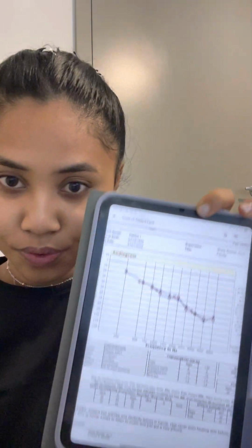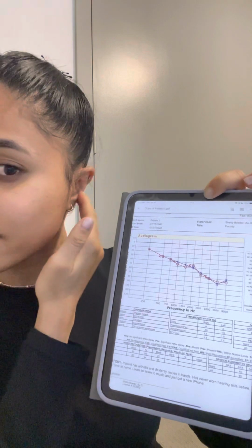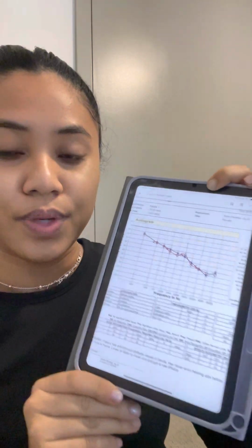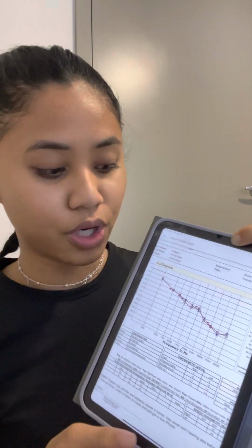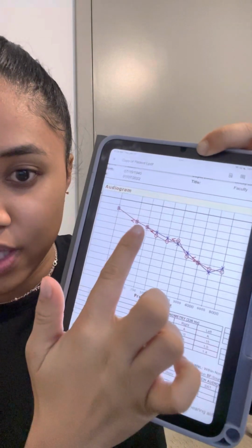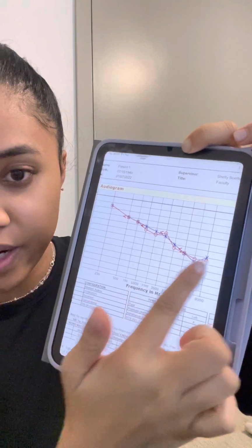All right, we are going to go over the results of your hearing exam. So I'm going to show you the graph as we go along, and I'll explain it as we go down. This is the results of your hearing exam that we did, where you listened for the tones that I gave you, and you pressed the button each time you heard a tone, even if and especially when it got softer. We'll start off with the red circles and the red connecting line right there.